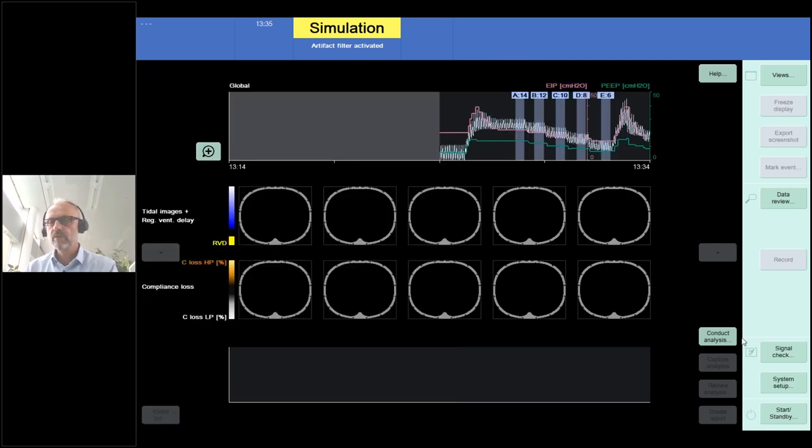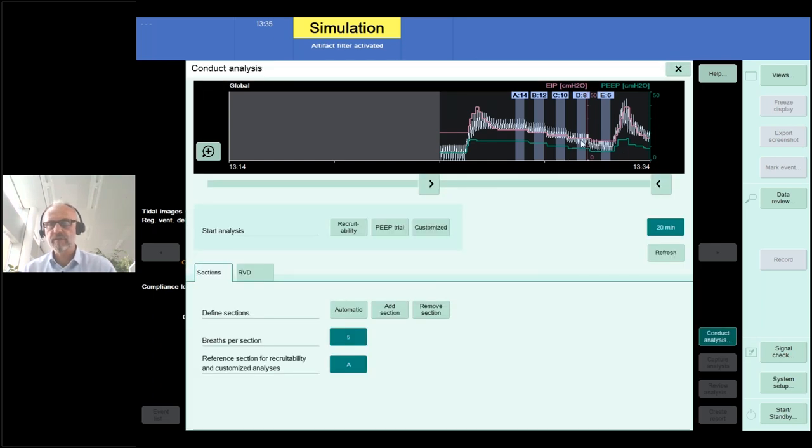And I'm not showing you any kind of nice examples. I mean, all the data, and that was a study including more than 40 patients, all the data of the study and every one of those patients, those PEEP steps were identified. And we really see, even though that is a very homogeneous patient population, all post-cardiac surgery patients, we always see those very different patterns. And it's kind of a surprise in every single patient we are observing.